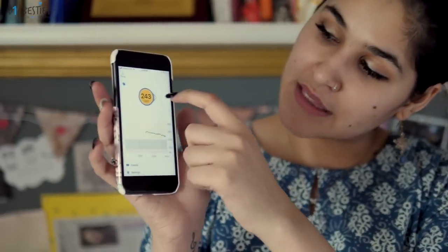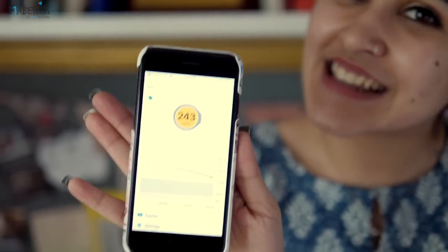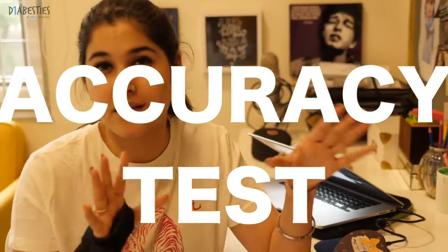It's been about 3 hours since I set it up and it's working awesomely. If I open up the app, there we go — my sugar is a little high right now. The moment it turned on after the warm-up it alerted me saying sugar high at 280, and I took some insulin. Now, as you can see, it's 243 and the arrow on the side means it's at a steady rate going down. I've just taken a little bit more insulin so it's going to come down more — there you go, my sugar is right in my phone!